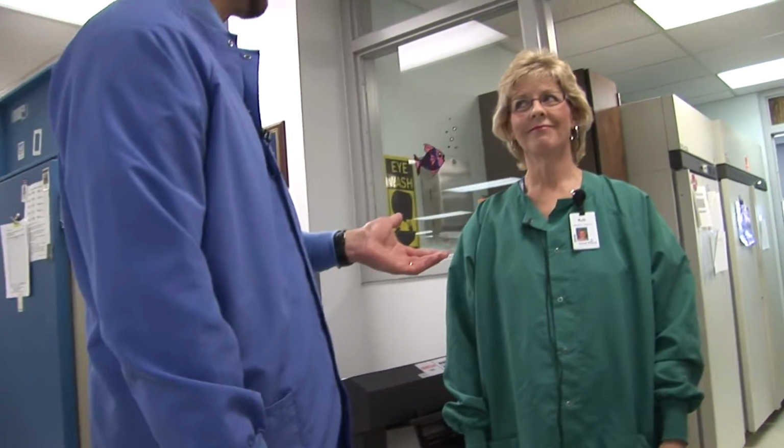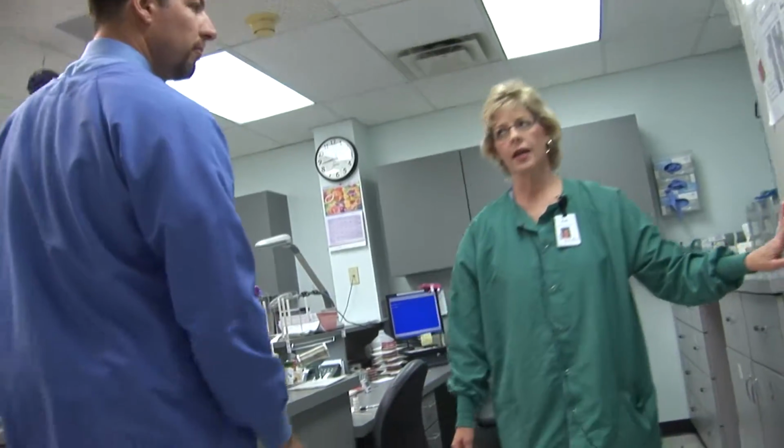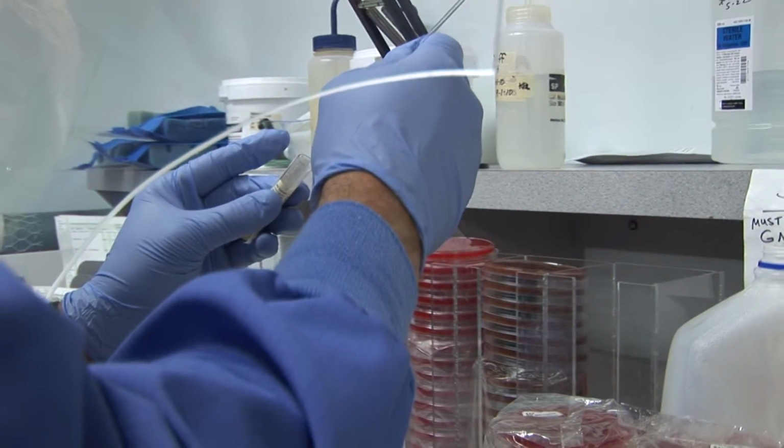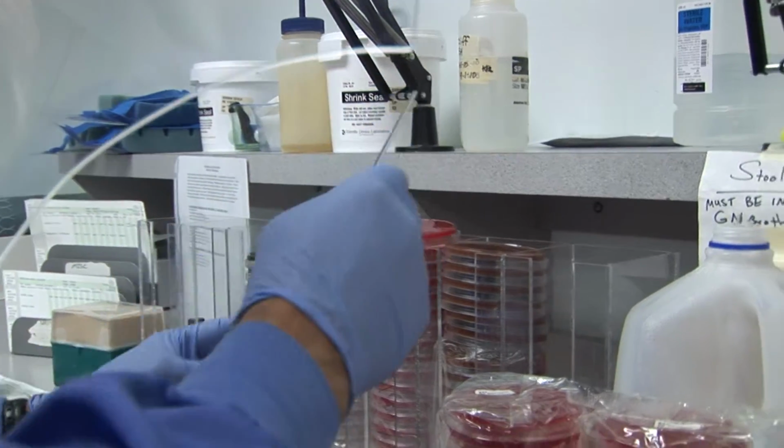Well, this is Ruth, and we're headed into microbiology. Yes, that's correct. What does that mean? Microbiology is the world of bugs, where we identify organisms that are causing patient infections. So I thought what we would do today is show you how to do a urine culture from start to finish. I just happen to have a urine sample for you. Okay, perfect.